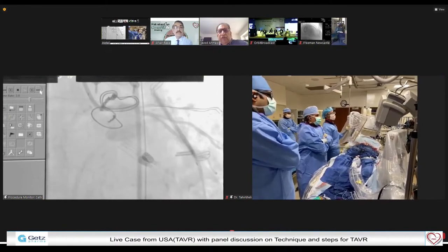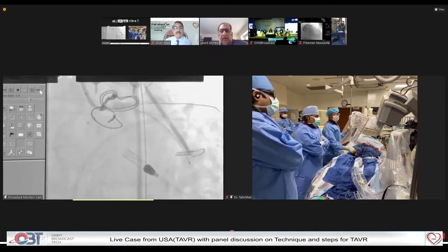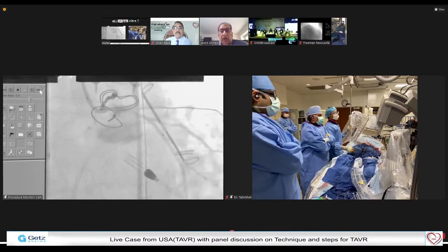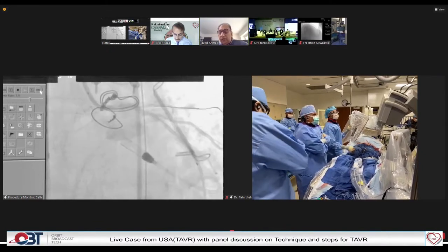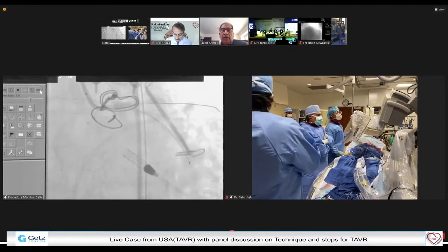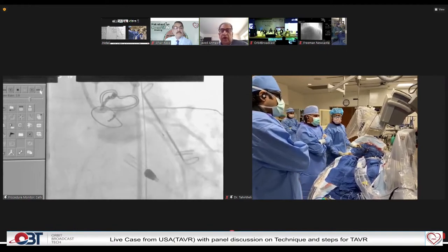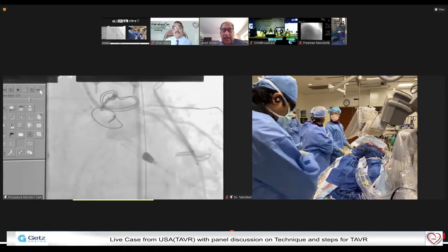The calcium is in the left main and it is not inside the stent. That's exactly right. You picked that up very well. Definitely, I would actually use a bigger burr at the start. I wouldn't use a 1.25, 1.5 burr because calcium nodules are one kind of calcium where you've got to use the biggest possible burr. Even I would start with a 1.75, go up to 2, and that would be really good.